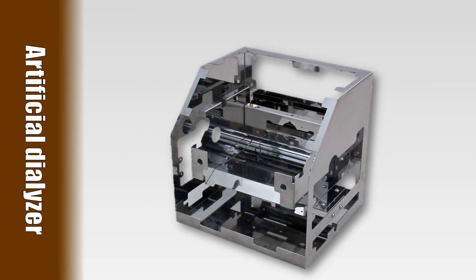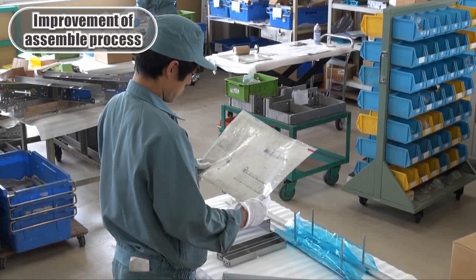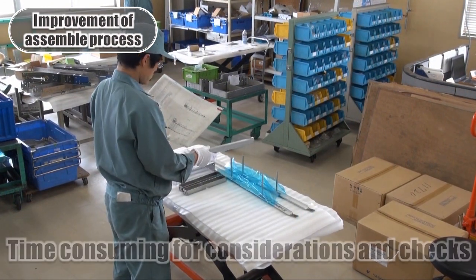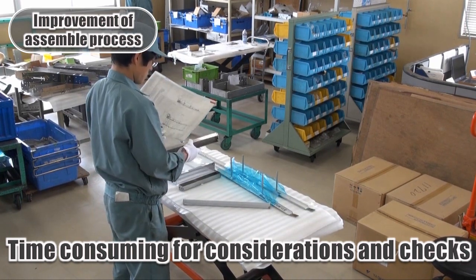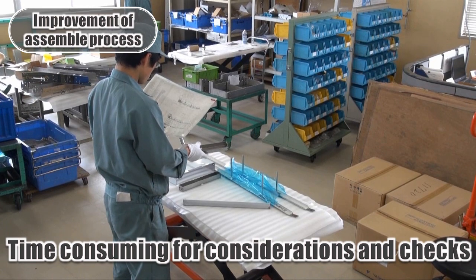Last is the artificial dialyzer. We will take the internal frame for an example to explain how we can improve the efficiency of the assembling process. The artificial dialyzer has many parts inside. Therefore, checking the position and the direction of assembly is an operation that takes time, and it often leads to mistakes.